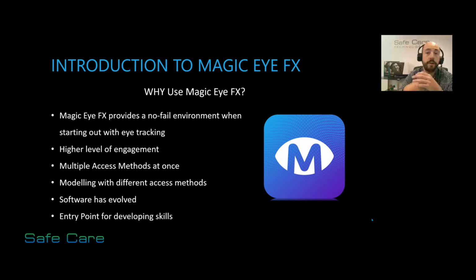And what we might have tended to do before was touch the screen to actually get that engagement going, maybe get the flare going across the screen. But what happens when we do that is we're actually encouraging that behavior, modeling that behavior of touching the screen. So the user themselves might lean to touch the screen and not realize that if they're an eye gaze user, it's just a case of looking at the screen and engaging. So we'll show you that in a while as well.